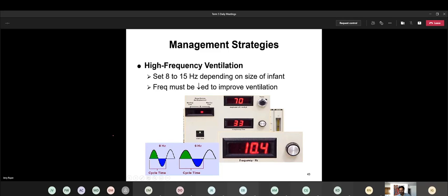Now the frequency, here's where it's like bizarro world. Everything is backwards when it comes to oscillators and frequency. Because we're doing hertz, we're generating extremely fast breath rates, like 8 hertz, 6 hertz, 10 hertz. First of all, your guidelines will tell you where to start your hertz.